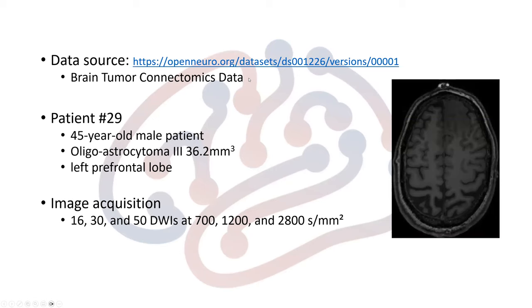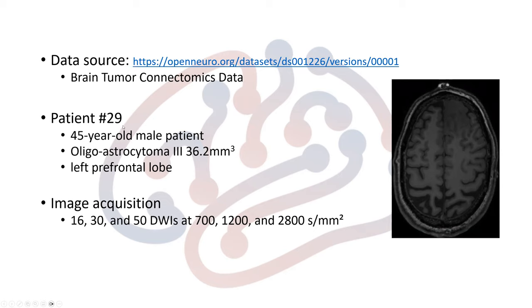The dataset we're going to use is the publicly available dataset at Open Neuro website. The repository is brain tumor connectomic data. I'm going to pick patient number 29, a 45-year-old male patient with an infiltrated tumor at the left frontal lobe. The data acquisition includes a lower B-value and higher B-value, but we're going to pick the one similar to DTI acquisition.